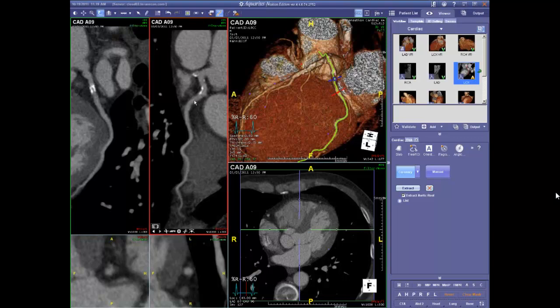So this is a patient who doesn't need a further workup. This may be very clarifying in terms of understanding his symptoms, which are quite likely to be non-cardiac. And I think we can sort of triage this patient into the correct treatment pathway without going on to a higher order, more expensive test or second and third opinions on the cardiology side of things.